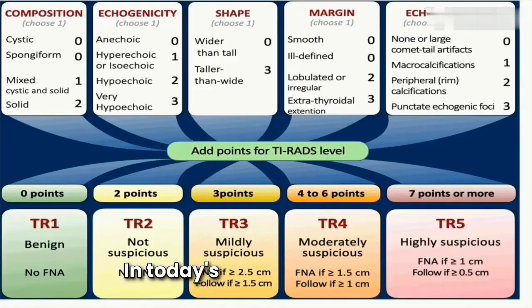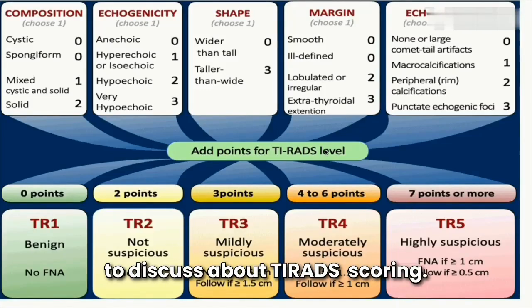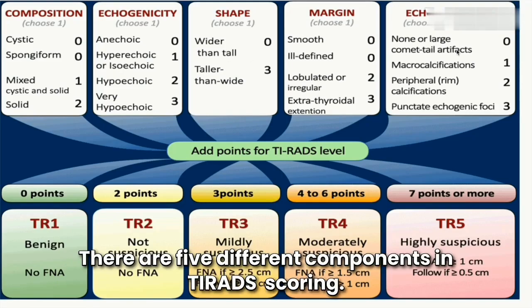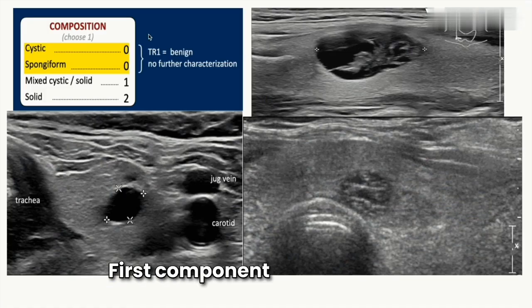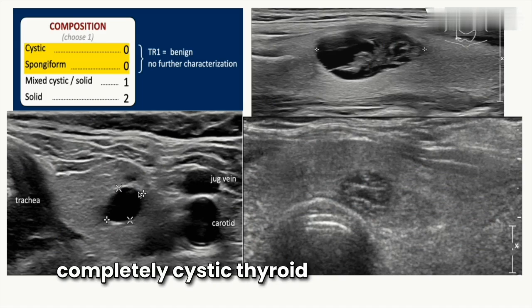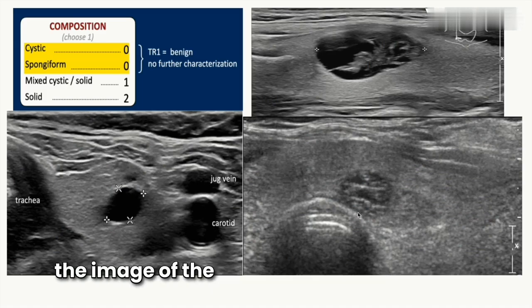In today's video we are going to discuss thyroid scoring. There are five different components in thyroid scoring. The first component is composition. This is the image of a completely cystic thyroid lesion, and this is the image of a spongiform thyroid lesion.